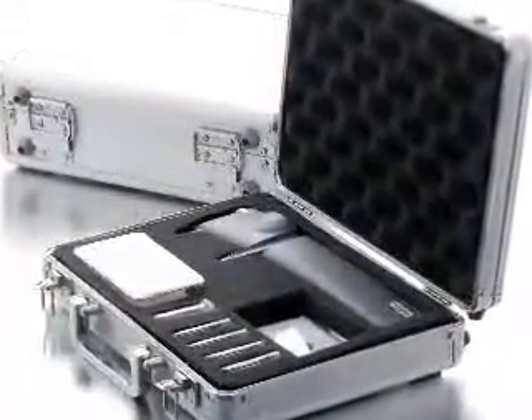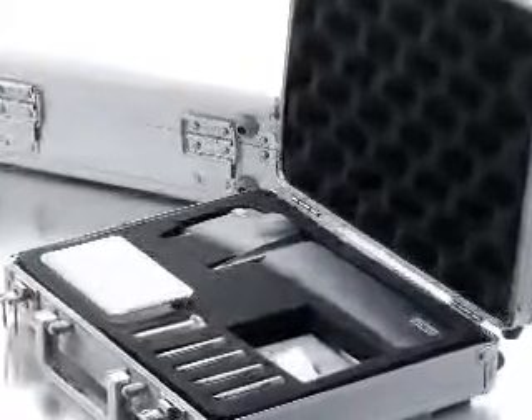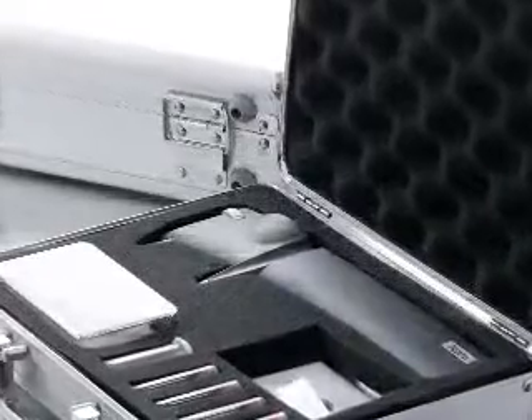The iCare Tonometer is delivered in a stylish, shock-absorbing aluminium case, with disposable probes, batteries, instruction manuals, and probe base.